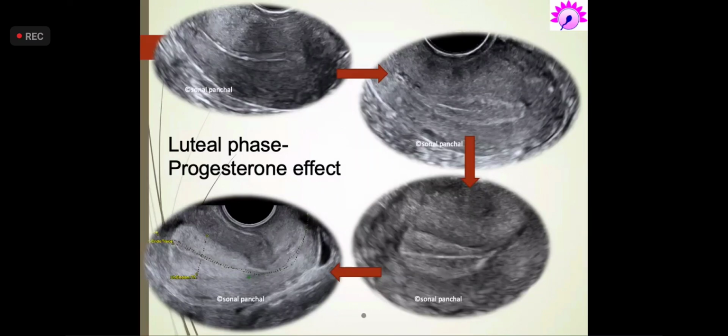So as long as the endometrium is fluffy with high uterine artery resistance, with high PSV of the follicle, it means that the surge has started. It is an assuring sign that the surge has started and you should do an earlier IUI. On the other hand, if you see that the follicle is already ruptured, but the endometrium is still fluffy, it means it's a fresh rupture and you can do an immediate IUI.